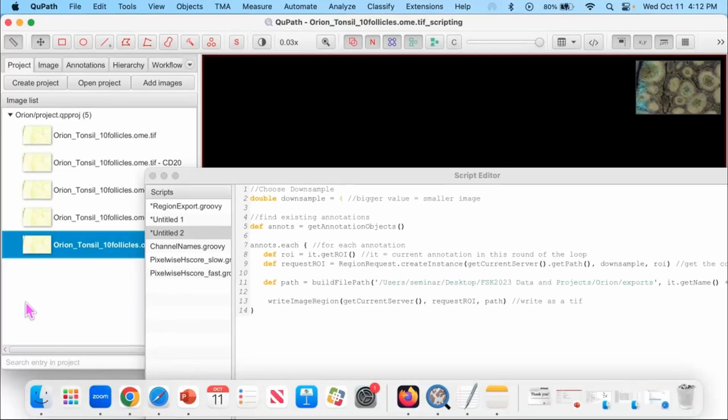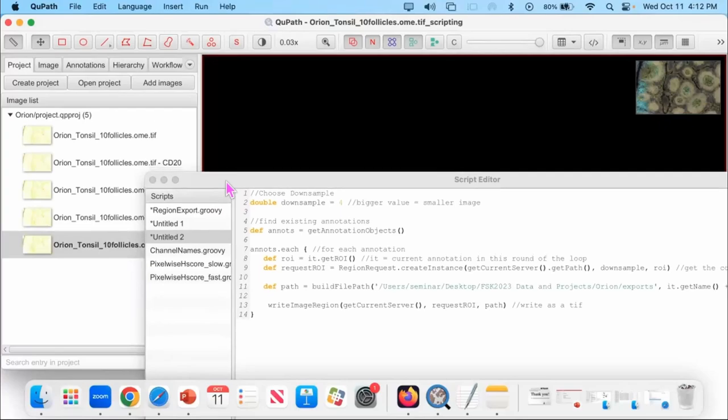I do ROI manipulation a lot when looking at vessels, either large blood vessels or bronchioles, where it's easy to find the lumen of the vessel, but what I really want is the wall. So you take the lumen and you have to go from there to finding the wall. And there are a couple of ways in QuPath of doing that.